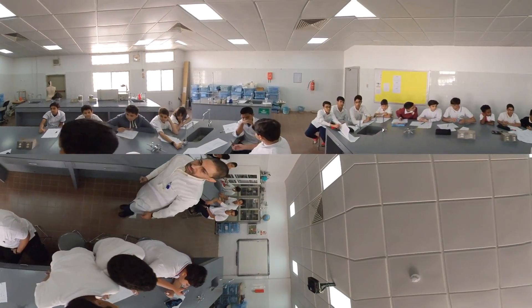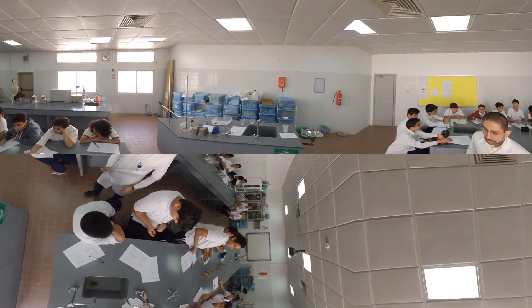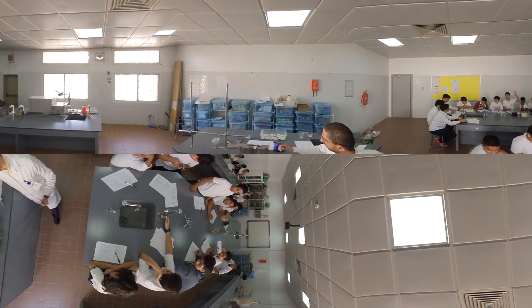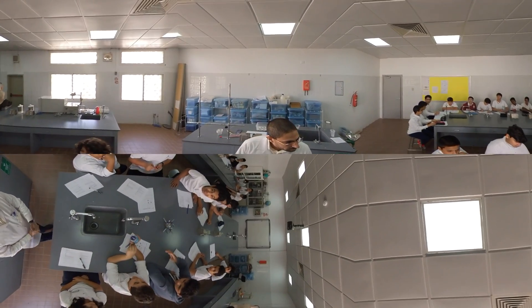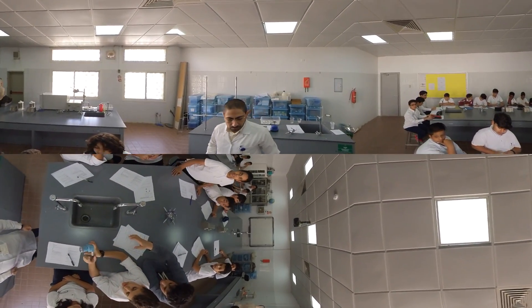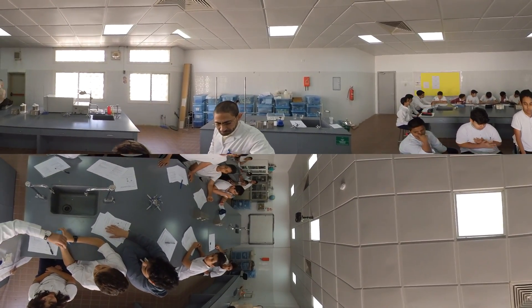Some students are not doing it. You didn't take your measurement — I'm going to give it to you. Take yours; it's already fixed. I'll write it down also. Remove the mouthpiece, please — the mouthpiece has to be removed.